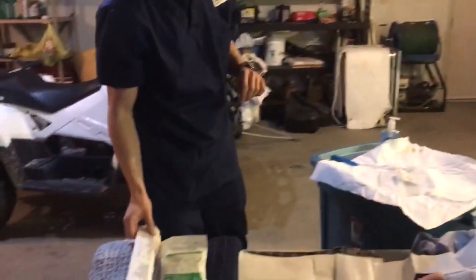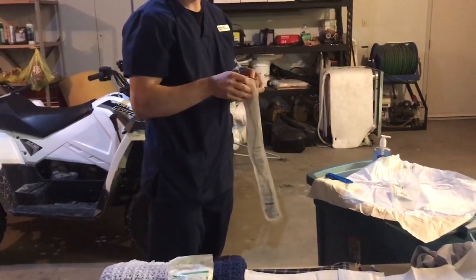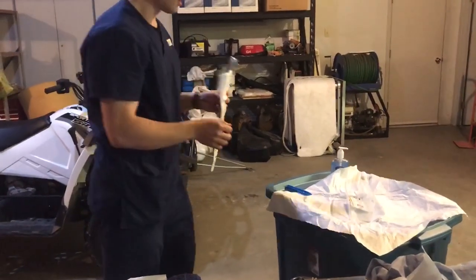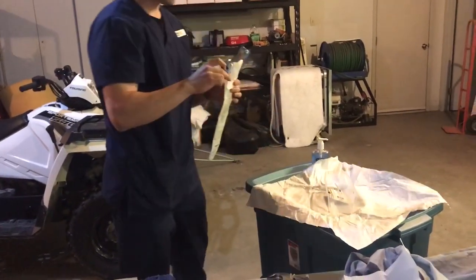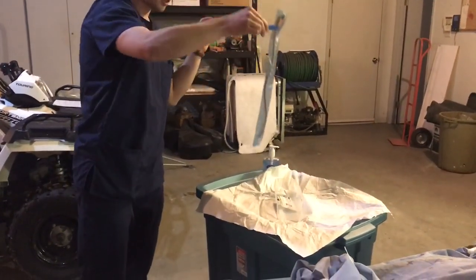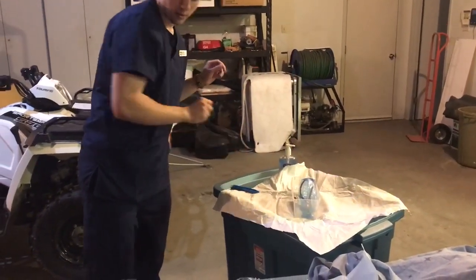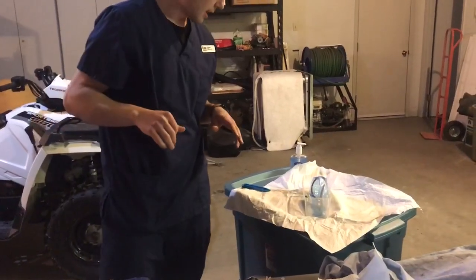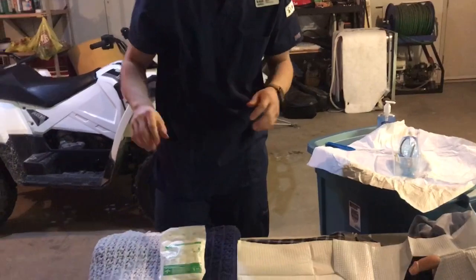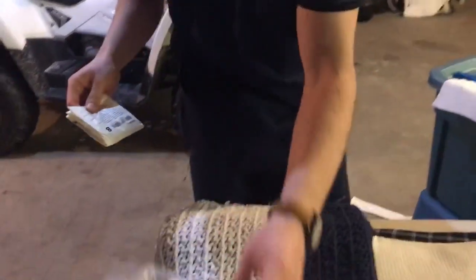Now that that's done, I'm going to grab my Foley catheter. I'll wing it open appropriately so we maintain sterility of the inner package. And I will use my forceps and pull it out of the package, throw that in the garbage, and add this to our boat. Once that's like that, I can do hand sanitizer, and I will go to the bedside and open up my sterile gloves. I can throw that in the garbage there.